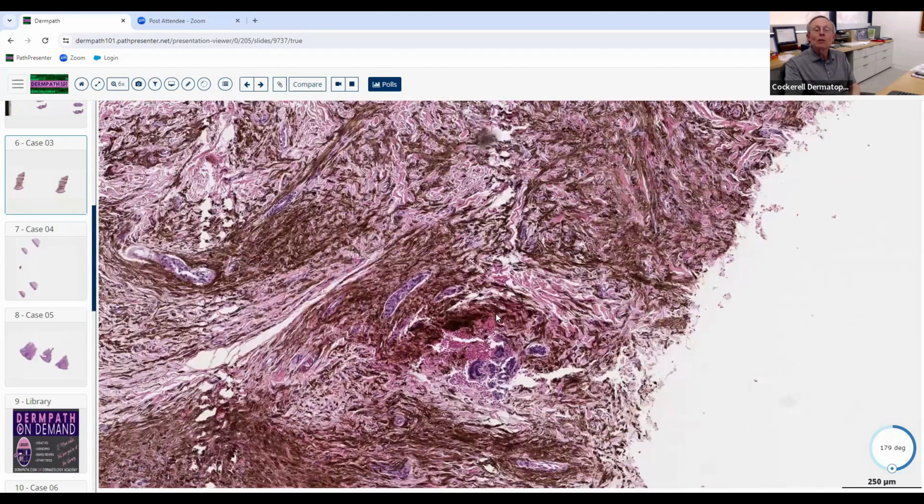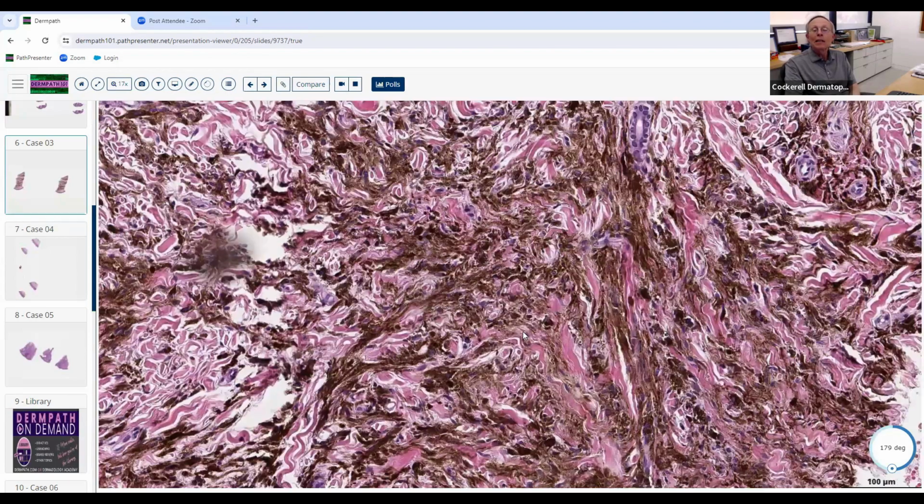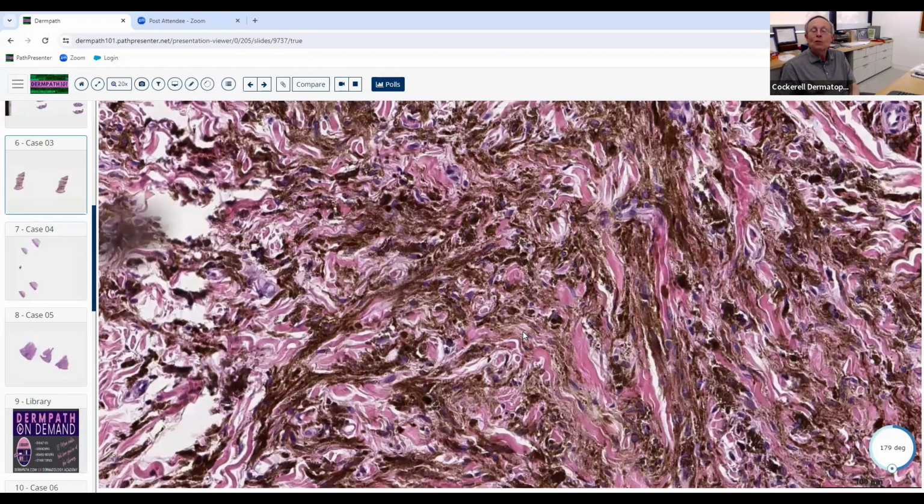In the old days, we used to take a microscope and you could actually rack down the condenser. And if it were refractile, that would favor that it's hemosiderin versus melanin. Looking at this field, do you think there's any chance that it could be something other than melanin? No, I see lots of globules. I would favor melanin. Yeah, these are fine, delicate granules.